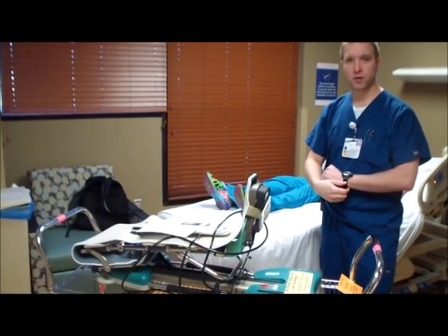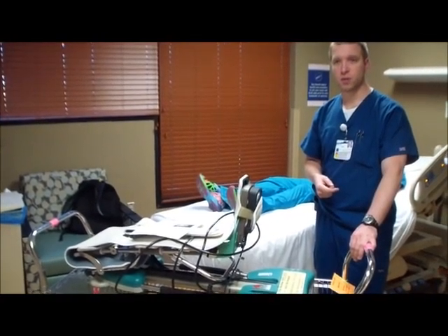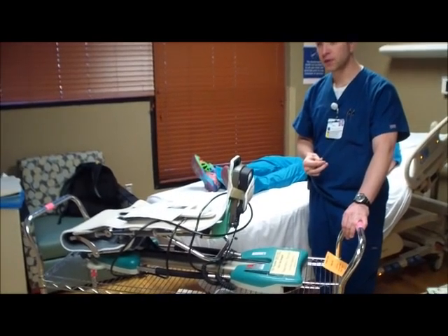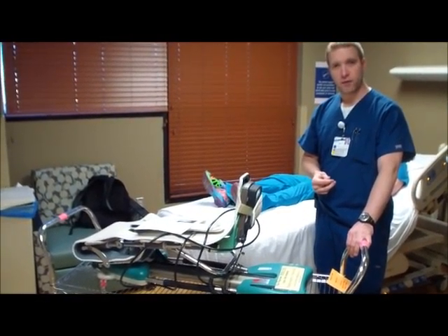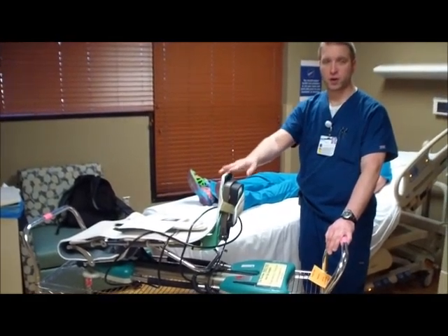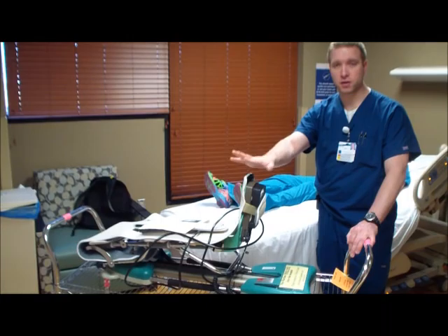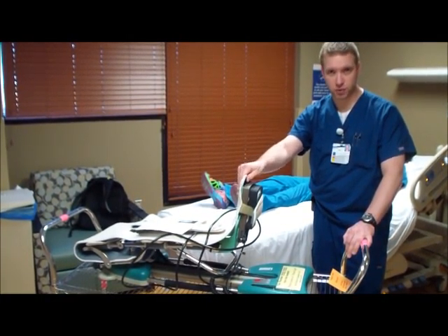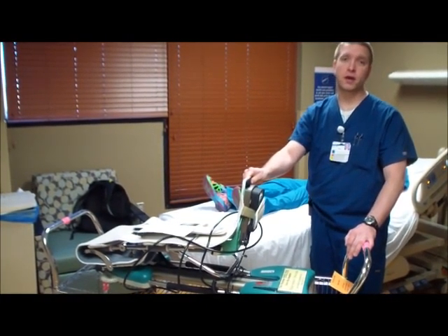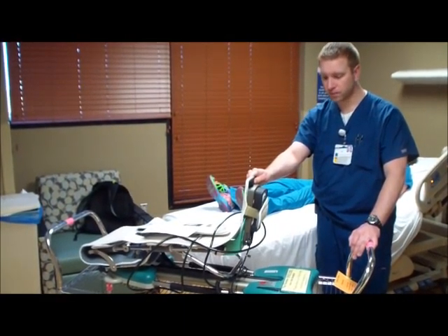Rarely will there ever be a code that needs to be placed in. If that is an issue, please let one of the therapists know. Once you arrive at the patient's bedside, what you'll want to do is get things ready. If the nurse can help you out, the nurse can help you out, or if you need to bring somebody with you, or if you're early in your training, you may need one of the therapists to come with you to check you off on this skill.